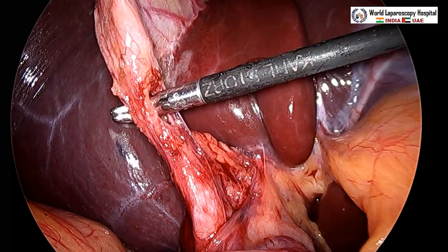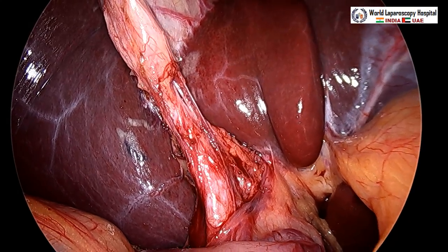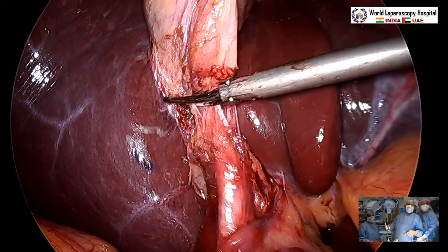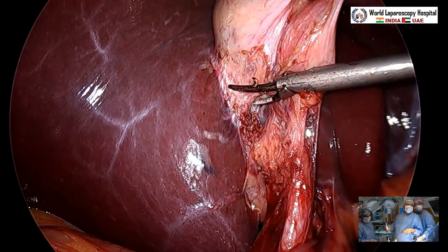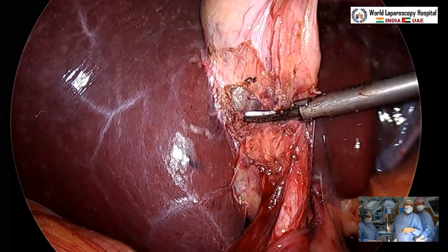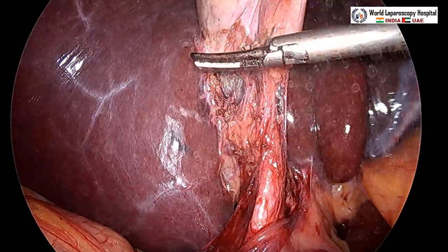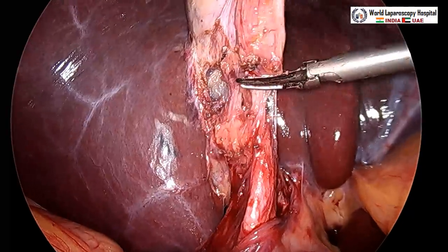The Maryland dissector opens its jaw between the artery and duct, defining Calot's triangle. We can clearly see the critical view of safety. Further skeletonization around the cystic duct and artery is carried out. The critical view of safety requires two structures going toward the gallbladder to be clearly seen, with two windows visible. The inferior surface of the liver is visible and approximately one-third of the gallbladder is separated from its bed. There is no structure entering the liver at that point.